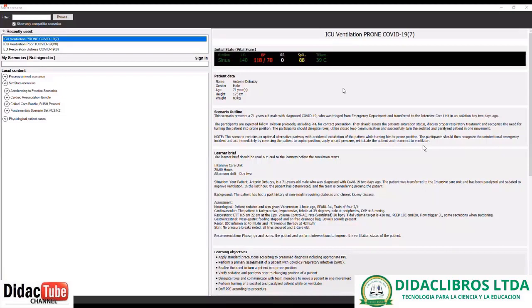Let's go over the learner brief. The learner brief we recommend to be read out to the participants. As I said earlier, you can change it if you would like to. It's now day 2 of this patient's condition. It's 8 o'clock at night and they're in the intensive care.